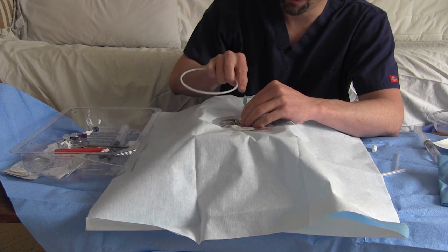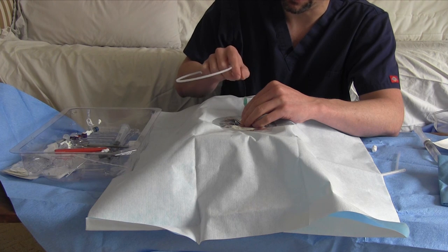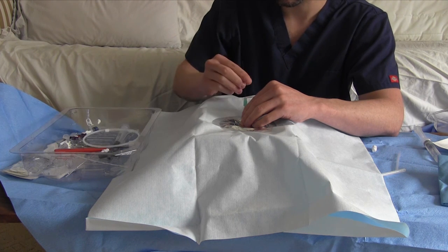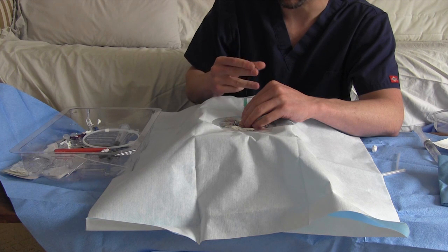And it doesn't have to be super far in, but if it goes in easily, you know you're going to be easily able to advance the catheter. So you can advance it up. And here's the back end. You don't want to use this back end. It is not floppy, unlike the central line wires, which you use both ends.